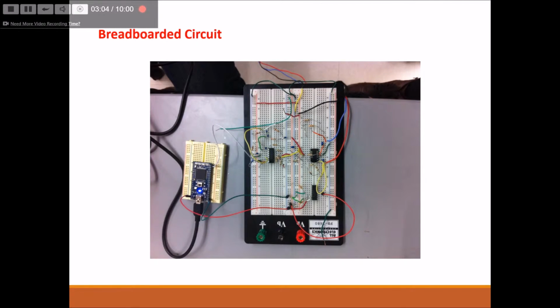Because of that, we developed a breadboarded version of the circuit. It is only a one-channel version of the circuit. However, it worked well for a proof of concept and our prototype. So here on the screen you can see our breadboarded circuit as well as the embed microcontroller that is hooked up to the computer. Everything is powered directly from the embed, so there's no other external power source.